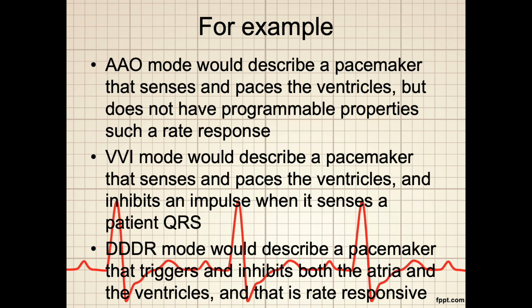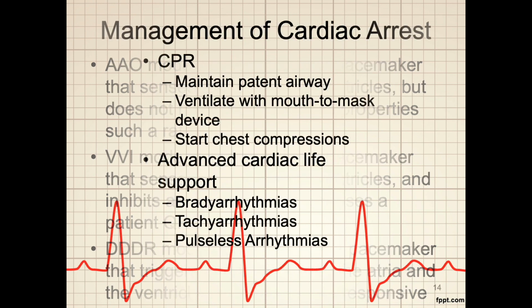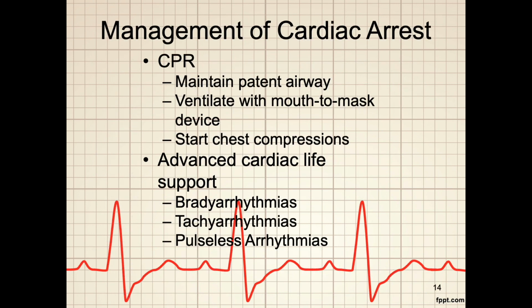metabolism. What you're hoping for when using a pacemaker is to avoid cardiac arrest. Let's briefly talk about cardiac arrest because although modalities such as closed chest compression, vasoactive medications, antidysrhythmic medications are those that come to mind when thinking about the management of cardiac arrest, we know that there's also going to be the use of electricity.